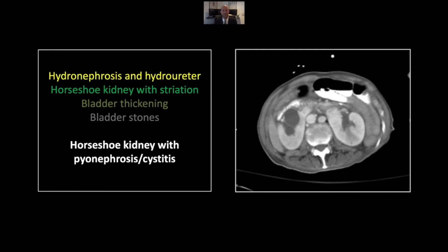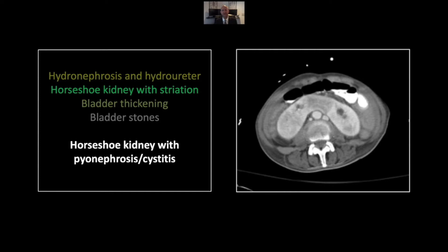Our next case is another pyonephrosis, but this one in a patient with horseshoe kidney. Patients with horseshoe kidneys have a tendency toward stone formation and anatomic obstruction of their collecting systems — this patient had both. We start with a dilated collecting system, more pronounced on the right than the left. Here you can see the wedge-shaped striated hypodensity characteristic of pyelonephritis in the posterior left kidney. This patient has a thick parenchymal isthmus, and you can see the striated hypodensity affecting that parenchyma as well.